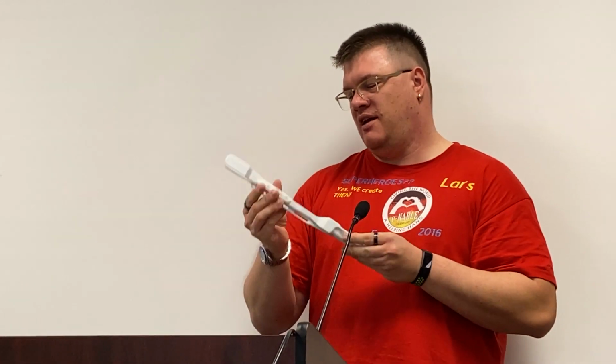So we came up with what we call a sports model, because the idea of the foot was just from the keepers. And then I said, okay, maybe the bird doesn't care about the foot. He just needs the 8 centimeters that were missing, like this piece was missing. And I came up with an idea for a sports model: no screws in it, lighter, like 180 grams. And he walks fine with that. He still walks fine with that.